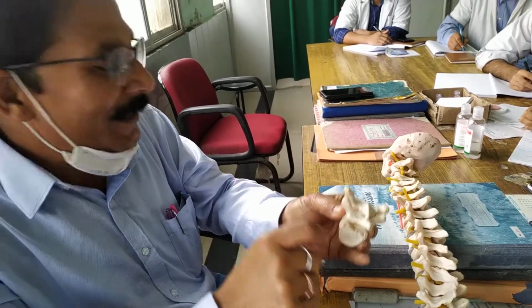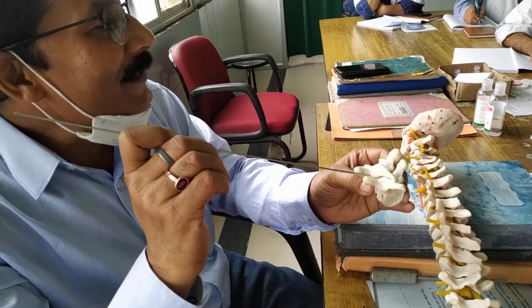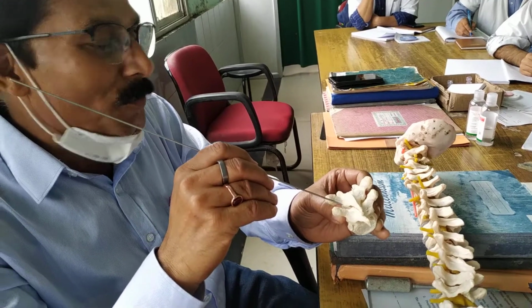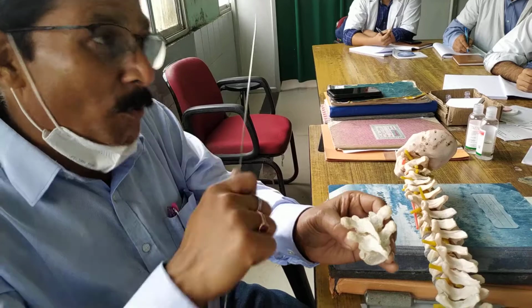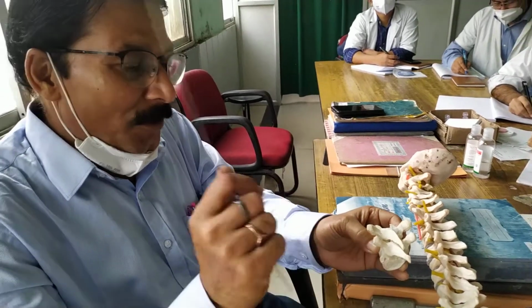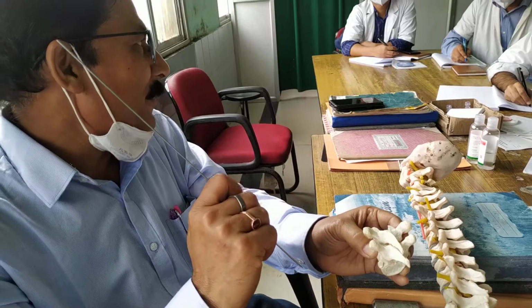And now see, this joint is there, but it is being covered by the various ligaments and capsule. Unless you do a very thorough dissection to trace it out, it will not be easy to palpate it also. Unlike in case of your lumbar area, where one can palpate it. So to find out the joint, you need to do a dissection there.